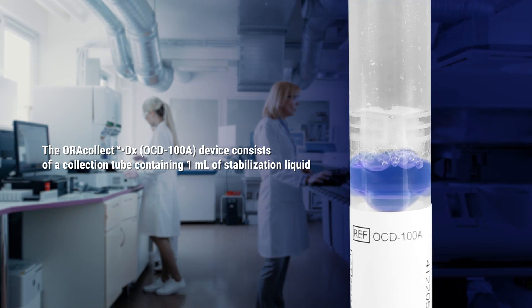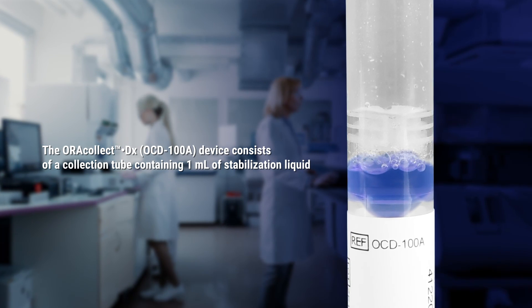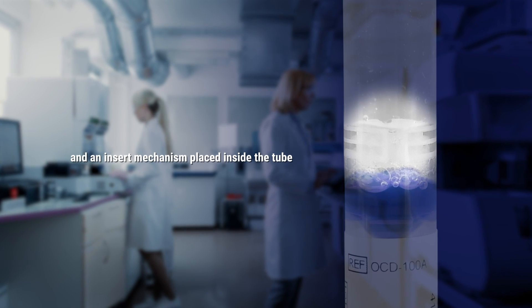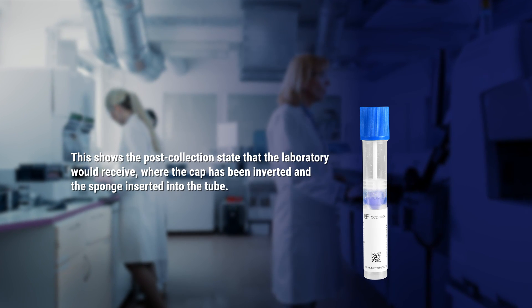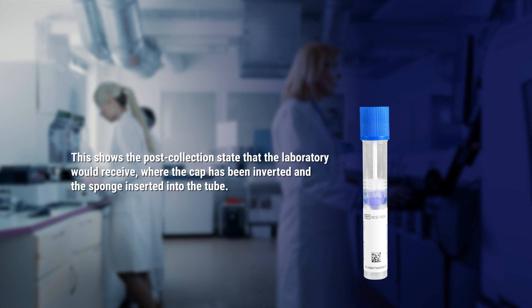The AuraCollect DX Device consists of a collection tube containing 1 ml of stabilization liquid, a double-ended cap with an integrated saliva collection sponge, and an insert mechanism placed inside the tube. This shows the pre-collection state. This shows the post-collection state that the laboratory would receive, where the cap has been inverted and the sponge inserted into the tube.